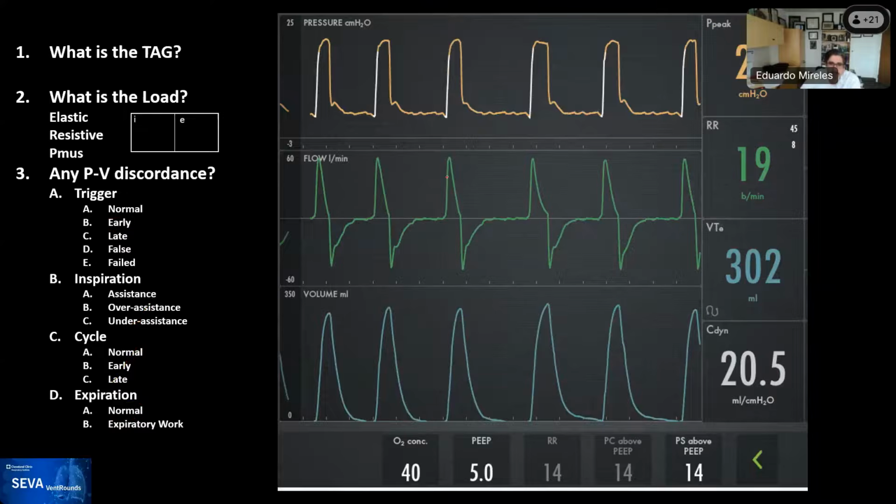And if the patient would fall below, so reaches an apnea time, I want you to talk about how that works, because that's not entirely clear in the manual. If I put a patient on auto mode, it's relatively easy to understand that if there's patient effort, it will go into only spontaneous breaths, as in this case, and that was the solution for this patient. But if the patient would go apneic or drop the respiratory rate, how does it go back to mandatory breaths? Can you talk about that?